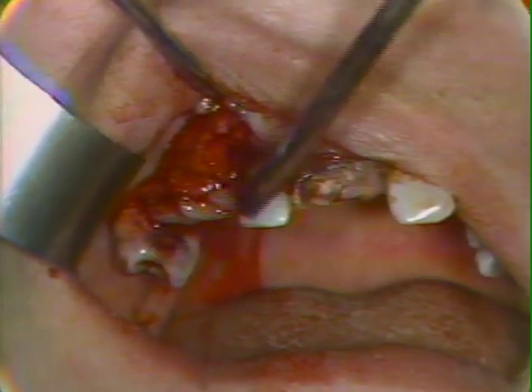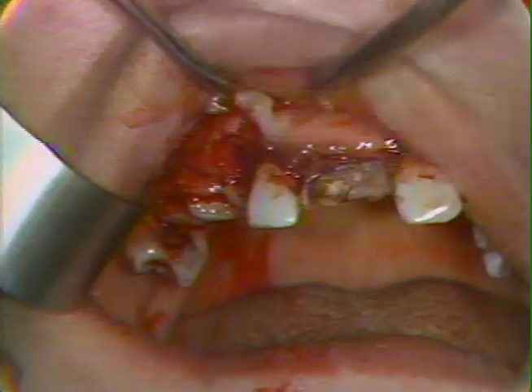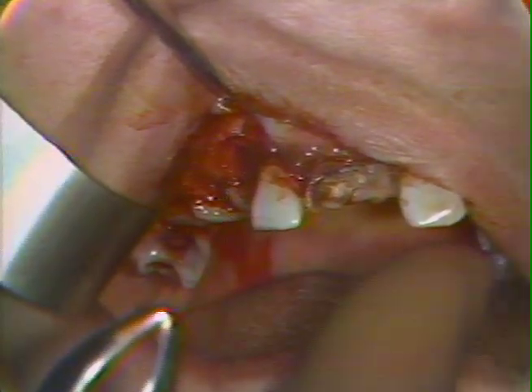Now we can proceed with the reflection of the flap more adequately for these remaining teeth. When we have that all reflected up at the free gingival margin, the flap will return to this field and we will proceed with the forceps delivery of some of the remaining teeth.